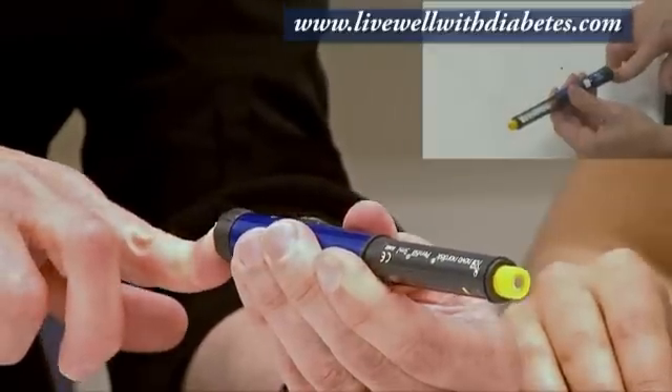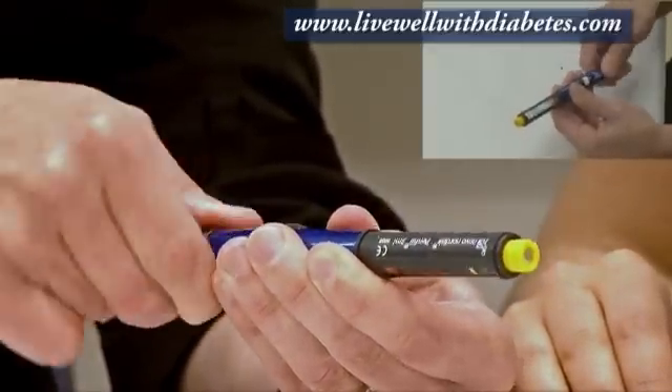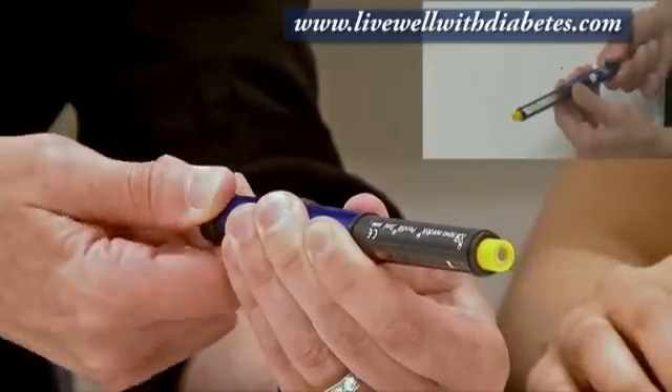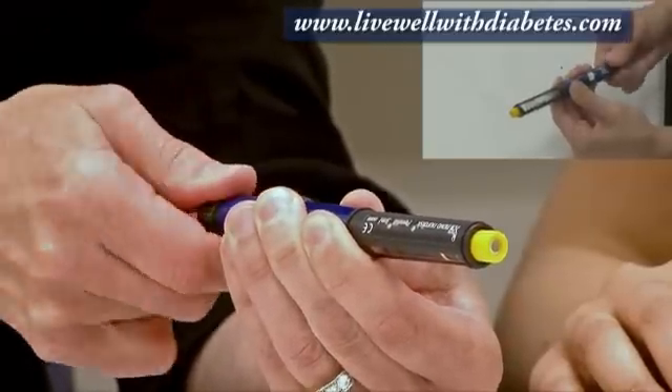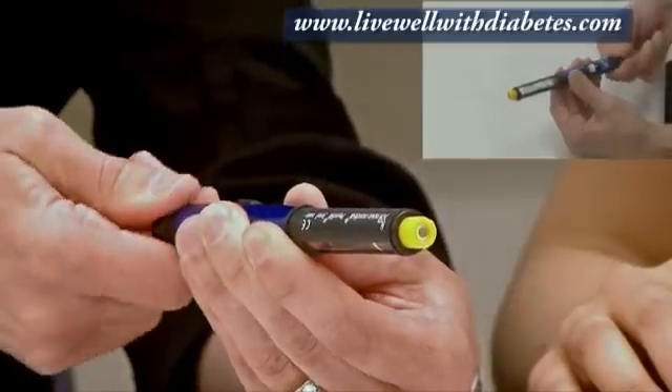This button — if I push it in, it's locked and I can't turn the dose. But if I pull it out, then I can actually turn the dose to different numbers. What's nice about this pen is that if I dial up and go past what I actually want, I can just dial back again.